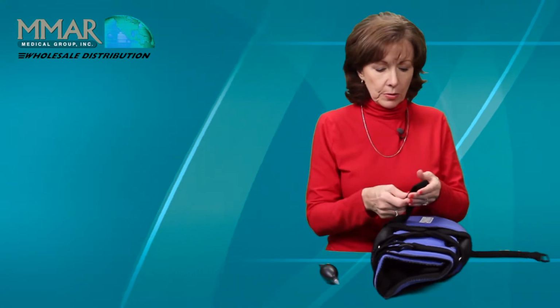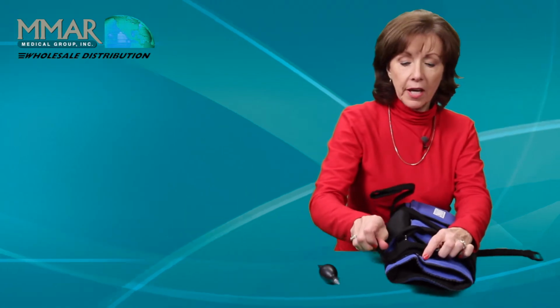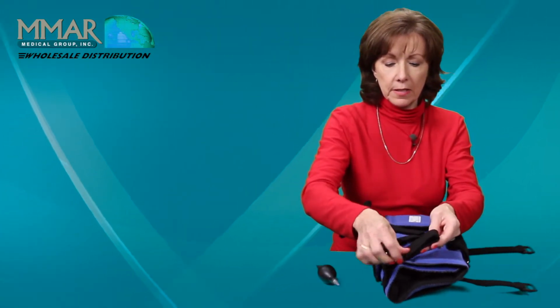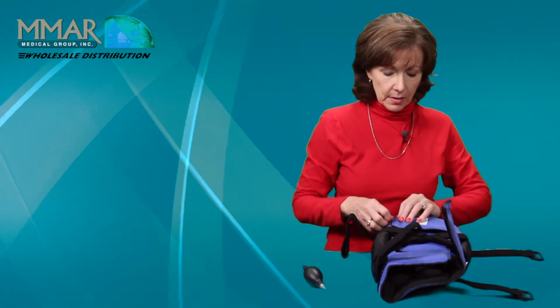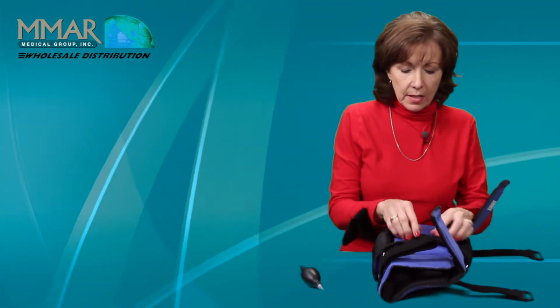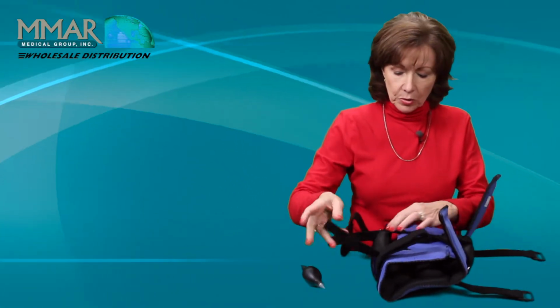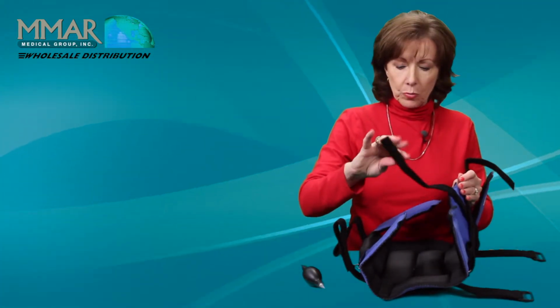You undo each strap, cuff strap. You want to always put the Velcro back on the strap. And then that Velcros, this Velcros, and you have 4 straps over your kneecap. When you initially fit the kneecap, you're going to work all 4 straps, and then after that all you should have to do are the ones outside.